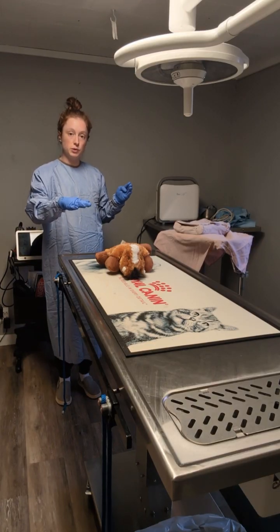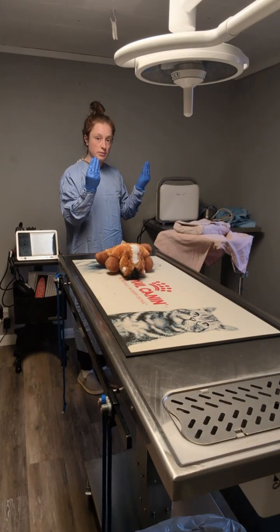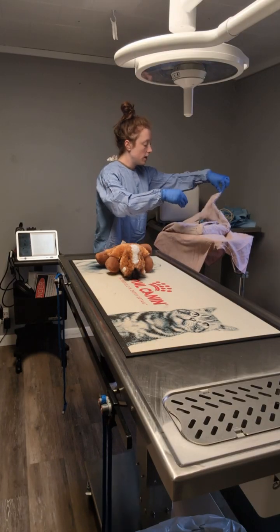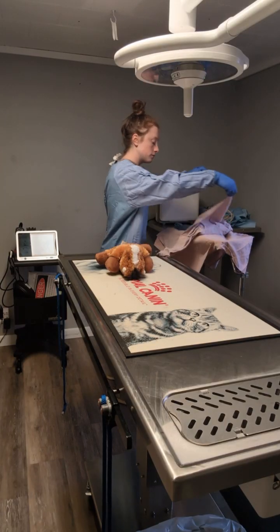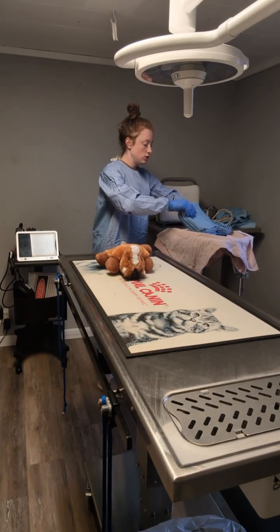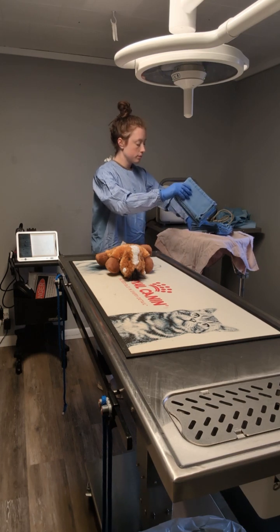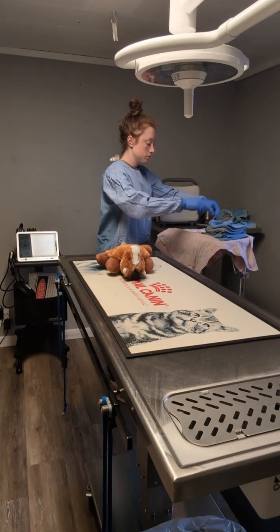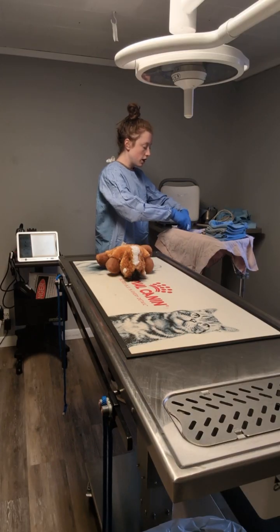I've got my patient in dorsal recumbency. I've got the first layer of my sterile pack already opened. Now that I'm sterile, I want to move slowly, make sure I am not touching anything outside of the sterile field. I will undo my pack, and I want to arrange the instruments just so they're easy to access for the doctor.